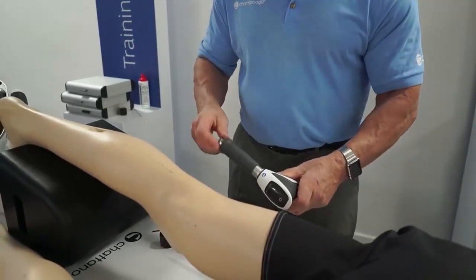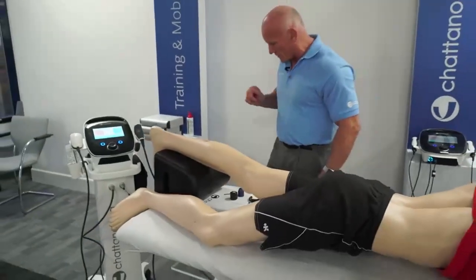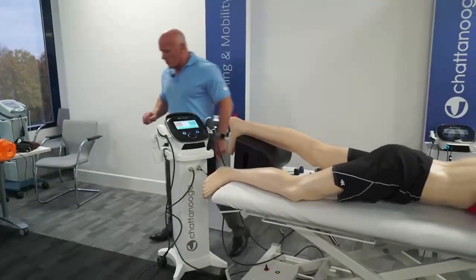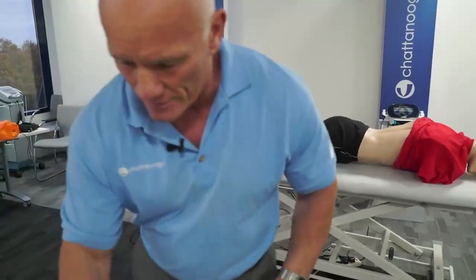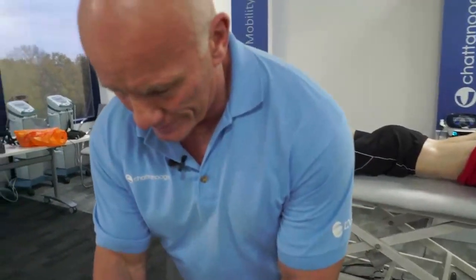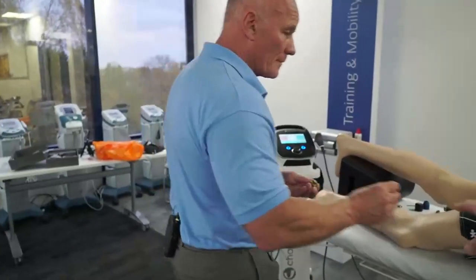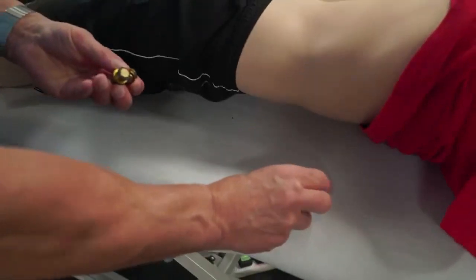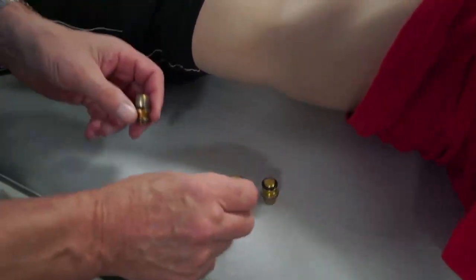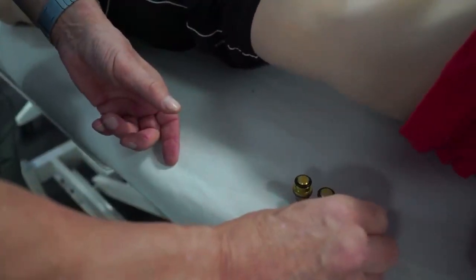Now, something else to consider, if we just come over to this table here, while you're doing that, is to look at those transmitters. Put them somewhere where the cameraman can see them. I hope you can see that.